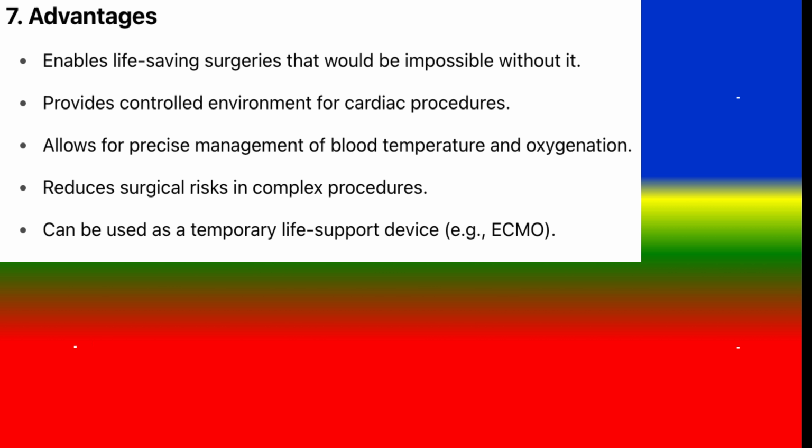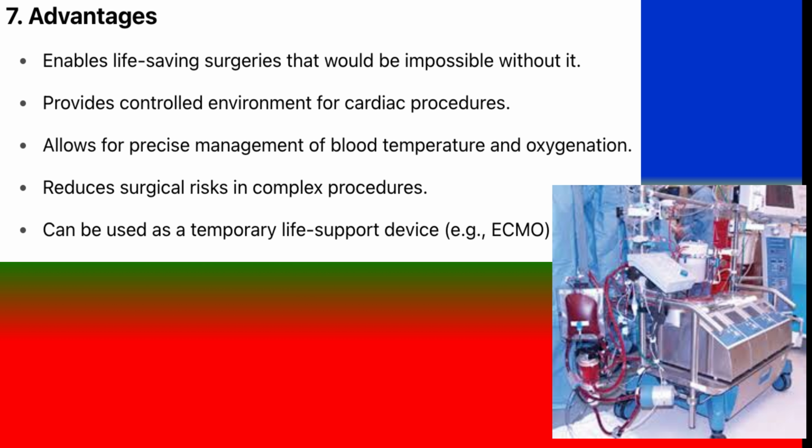7. Advantages: enables life-saving surgeries that would be impossible without it. Provides a controlled environment for cardiac procedures. Allows for precise management of blood temperature and oxygenation. Reduces surgical risks in complex procedures. Can be used as a temporary life support device, e.g., ECMO.